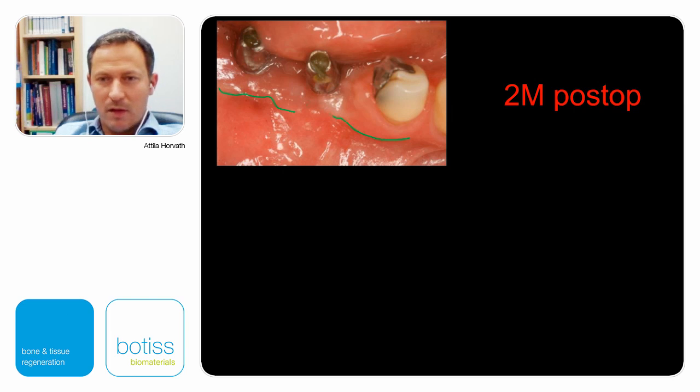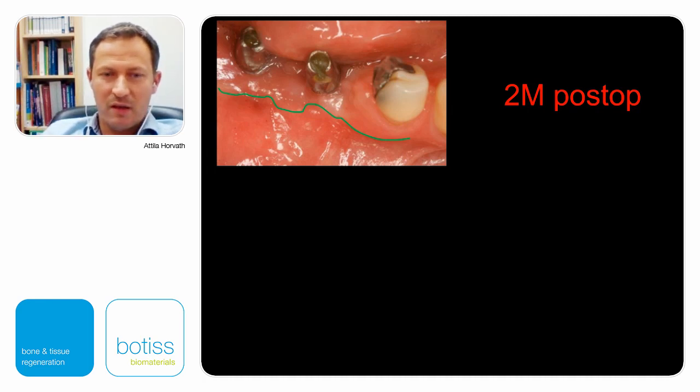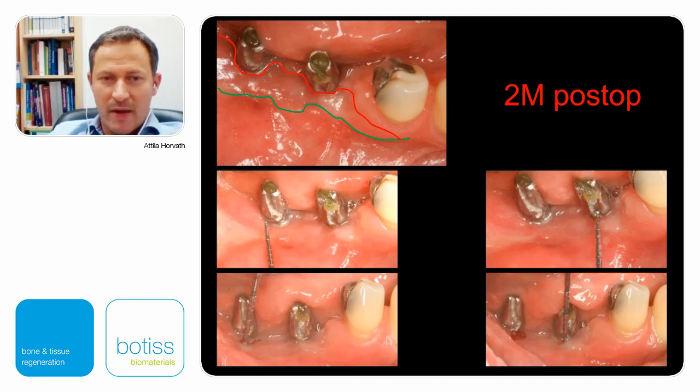Okay, a little bit of delay in the computer. Good. And this is the new line of the mucogingival junction. So we gained a nice amount of keratinized tissue, and we still have 2 to 3 millimeters buccally to the implants. That was previously, and this is a nice tissue now, when we can see the Hungarian national flags in the picture. So 3 millimeters, 2 millimeters. And interestingly, when I measured the pocket, there was a reduction observable at the implant, because there was 4 and 3 millimeters of pocket depth 2 months after the soft tissue surgery and the non-surgical cleaning.